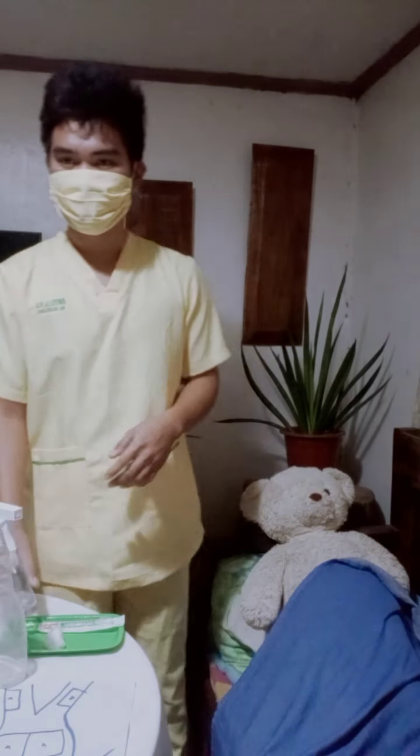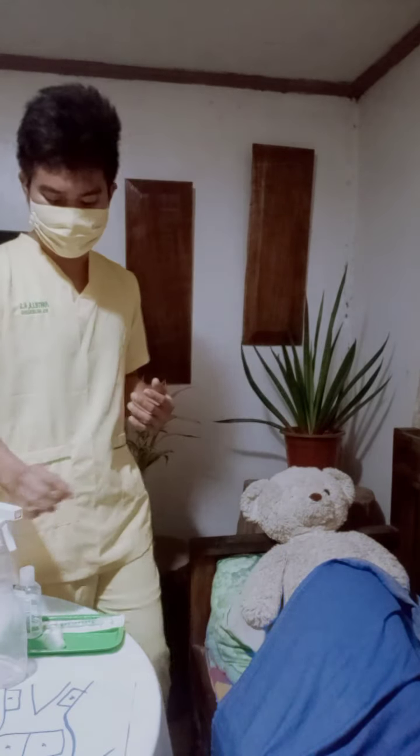And next, we're going to demonstrate the steps necessary to draw up the medication. We're going to demonstrate how to draw up the medication. We need to perform it as a nurse first before our patient.